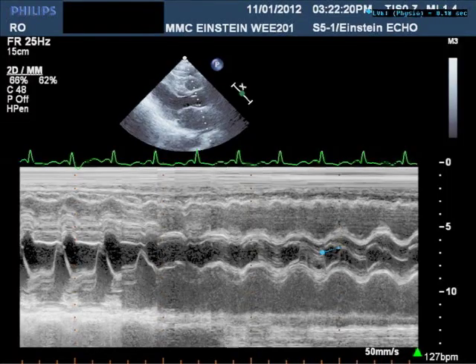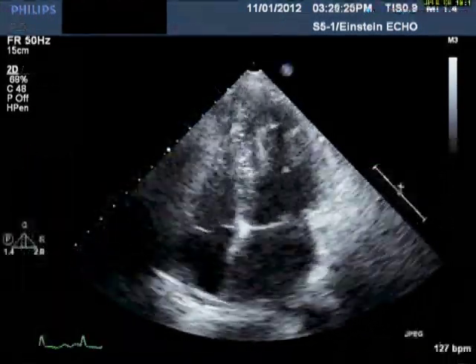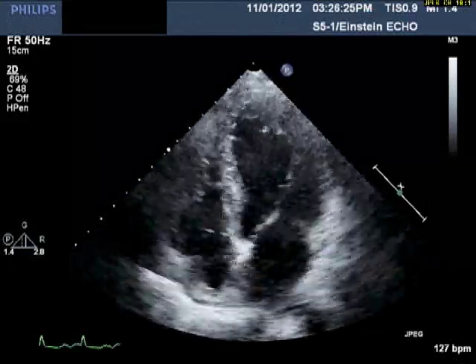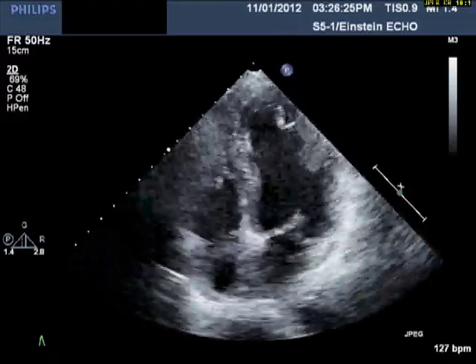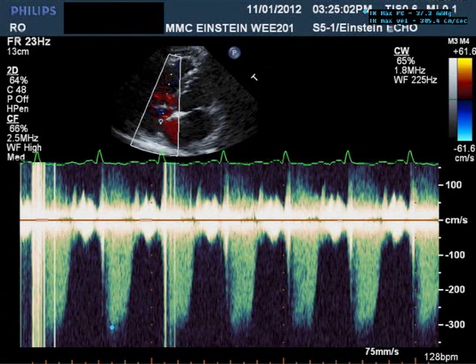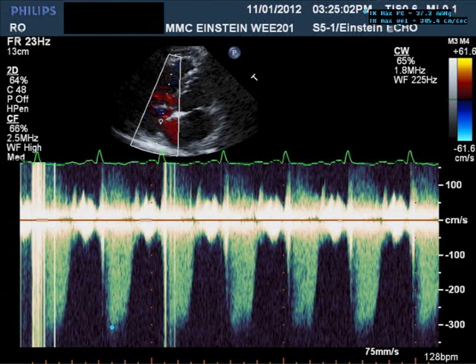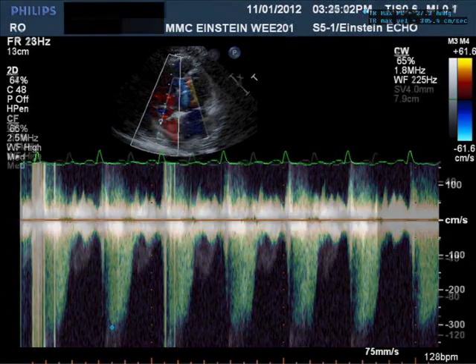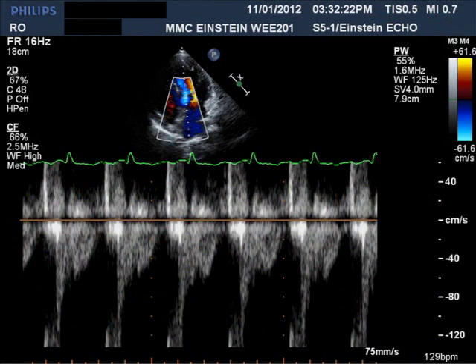Take a look at that for a second. You now see an apical four-chamber view, 2D image only. In the next slide, you can see a continuous wave Doppler through the tricuspid valve with a maximum velocity of the tricuspid regurgitant jet of slightly more than 3 meters per second. This is a pulse wave Doppler through the left ventricular outflow tract.